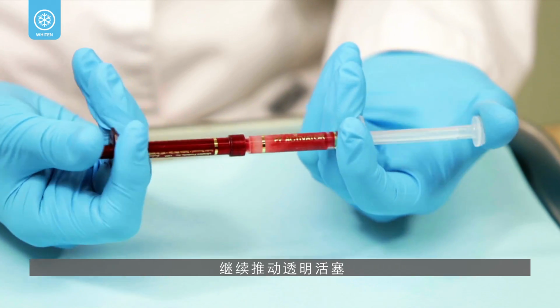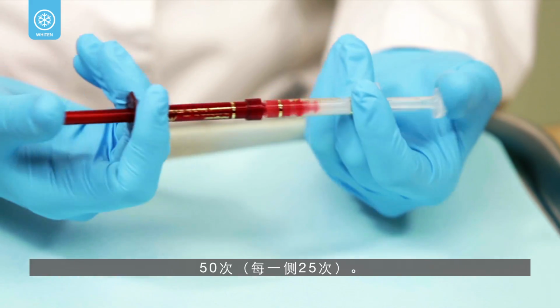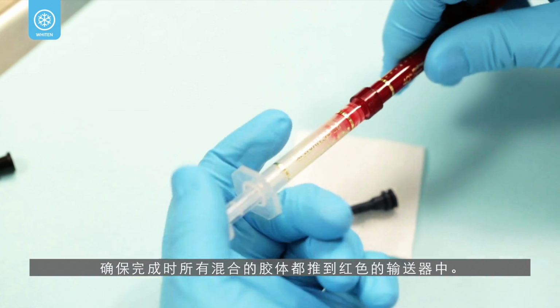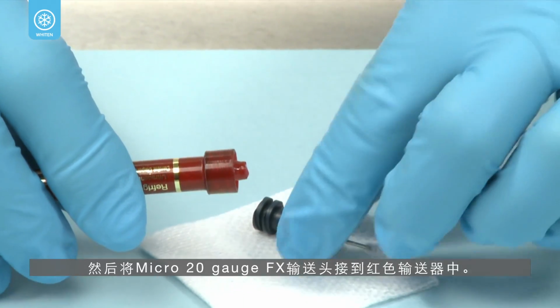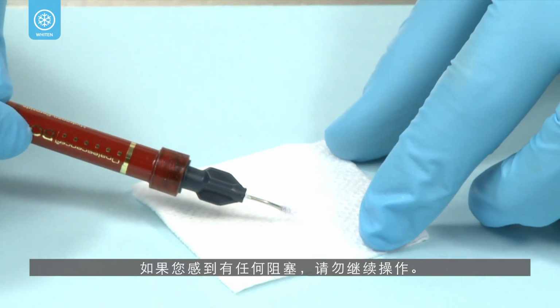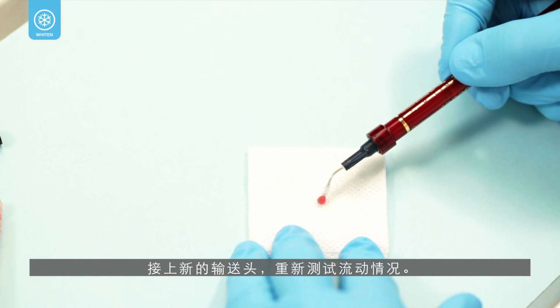Continue depressing the clear plunger so all of the gel is in the red syringe. Reverse the action and mix a minimum of 50 times total or 25 times on each side. Be sure to finish with all the mixed gel in the red syringe. Twist to separate the two syringes. Discard the clear empty syringe and attach the Micro 20 gauge FX tip onto the red syringe. If you feel any resistance, do not proceed. Attach a new tip and test the flow again before applying Opalescence Boost to the teeth.